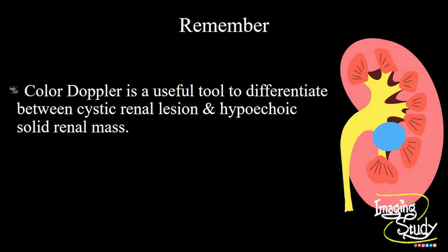The take-home message: color Doppler is a useful tool to differentiate between cystic lesions and hypoechoic solid renal masses. So if you have color Doppler facility, don't forget to use it when you see a renal cyst.